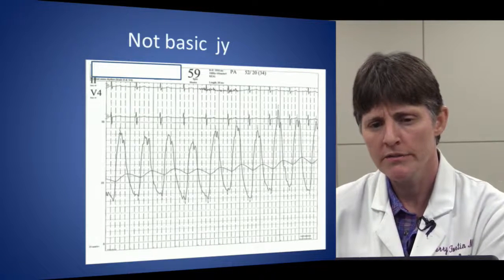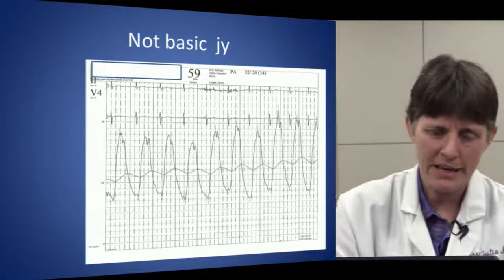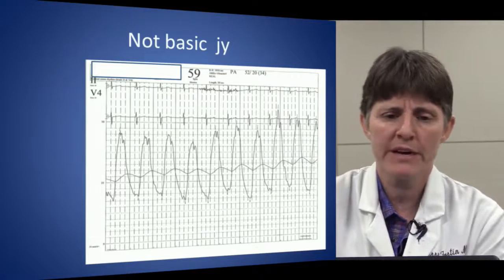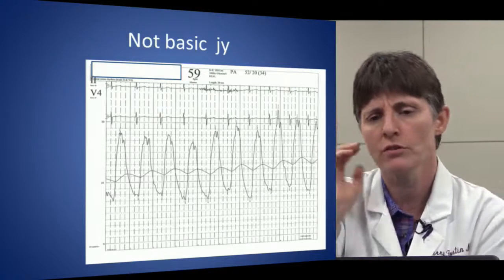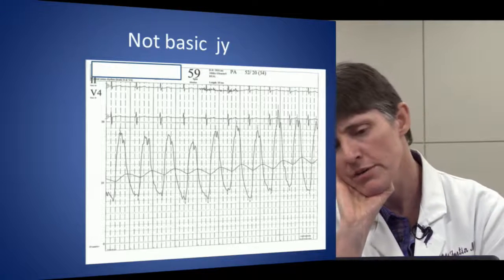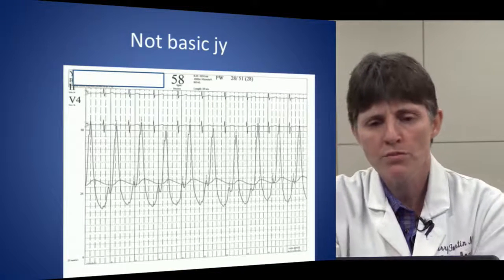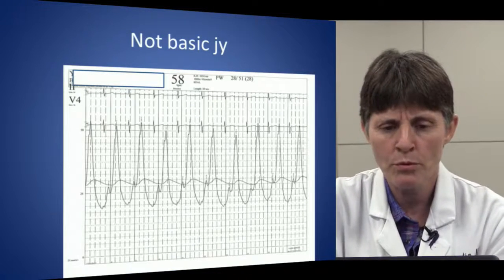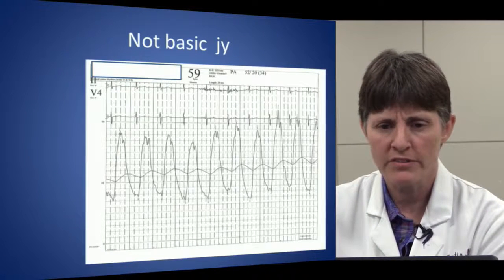And this here is a PA tracing. And if we look at that dicrotic notch at the top, it's very high, and it's a little bit unusual. It's not just a smooth triangle. It's got this little glitch in it. And you think, well, why is that? And when we then move to the wedge pressure here, again, it's not a normal-looking wedge pressure. You could almost look and say, these are on the same scale.